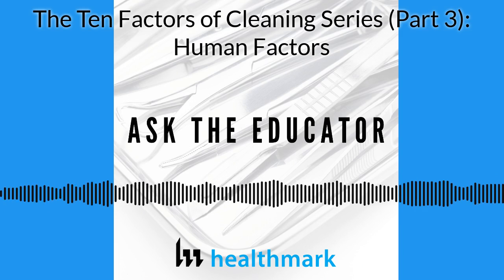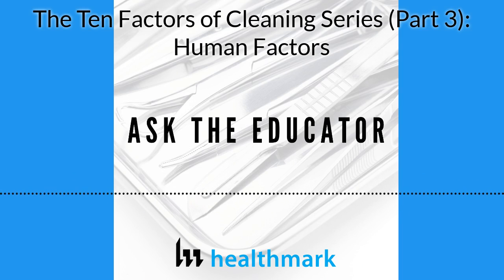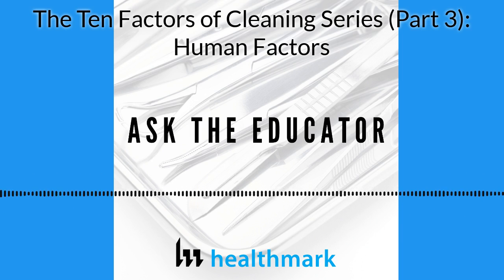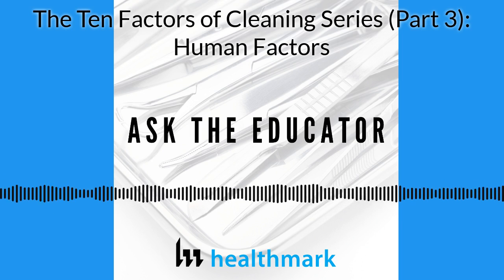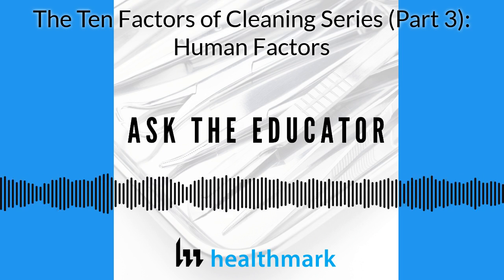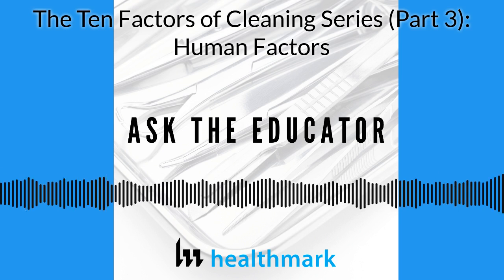Yeah, it is. And it was a really simple, basic question. It said, Steve, are these factors really the steps in the cleaning process? And I got a hold of the person who says, no, your steps of the cleaning process are pre-soaking and manual, automated, and more or less the life of the instrument, because then it goes to assembly, inspection, and so on.